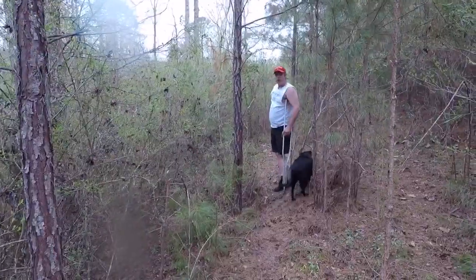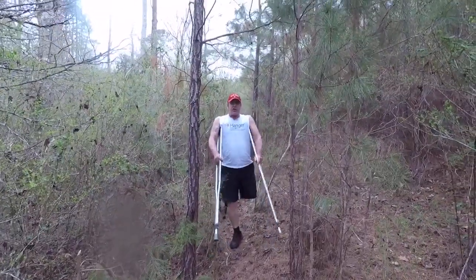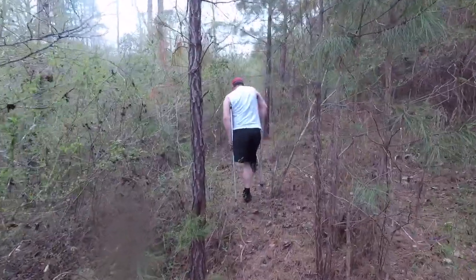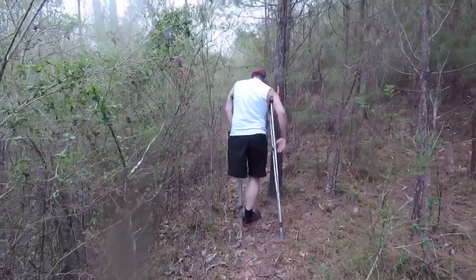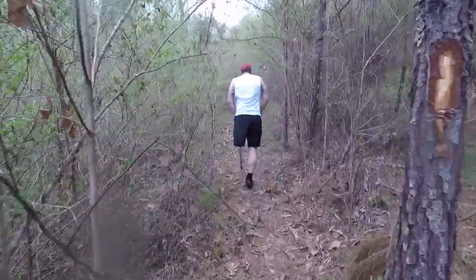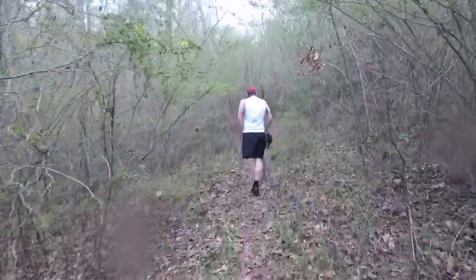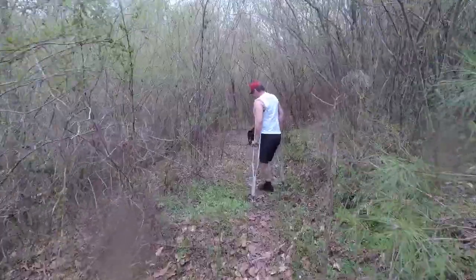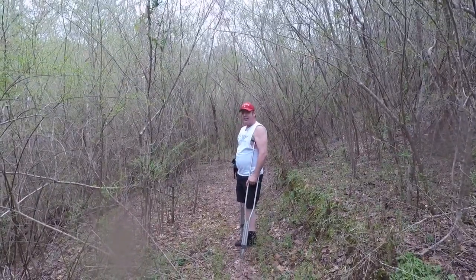Let me show you one more thing coming up — you've got a little narrow pass right here. When you're crutching, you're not always just going straight forward. Sometimes you've got to go through like this, and I'll show you right here. If you're out on crutches and sometimes you're running behind, you've got to go through a little quick pace — here's what it looks like.